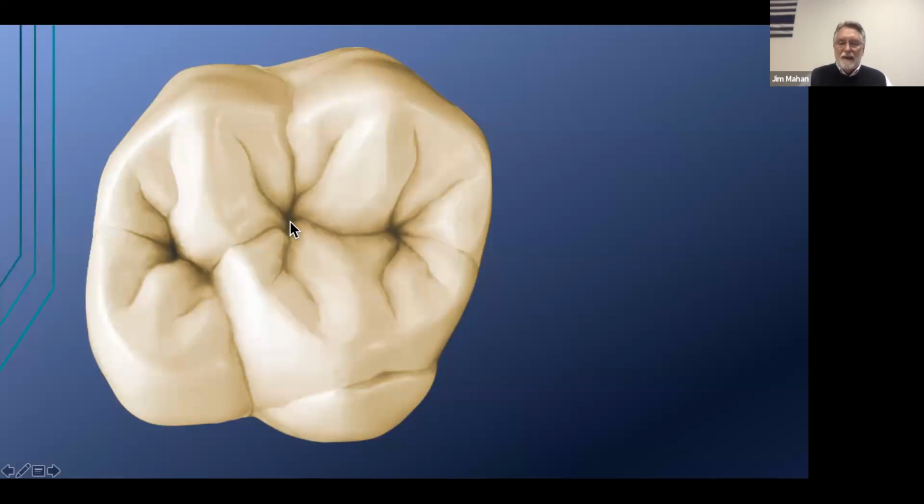These grooves that I said always start in the pit and stop just shy of the occlusal perimeter. It's quite simple. Do they always do that? On a worn tooth, can I make it shorter? Could I make it longer? Could I make it more angled? Could I make it not quite 45 degrees? I could do all of those things, but I couldn't even think about that unless I had a stable reference saying more or less than 45 degrees, not quite midway between the crest of the ridge and an adjacent groove.